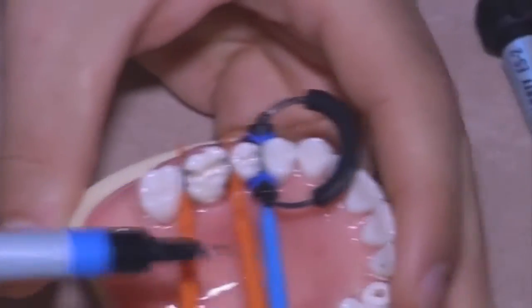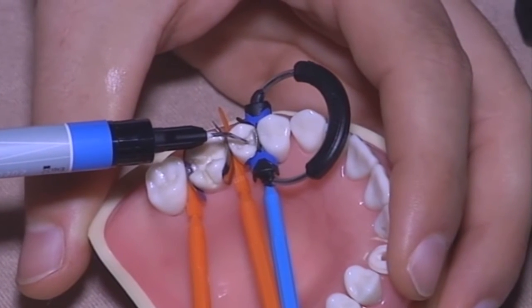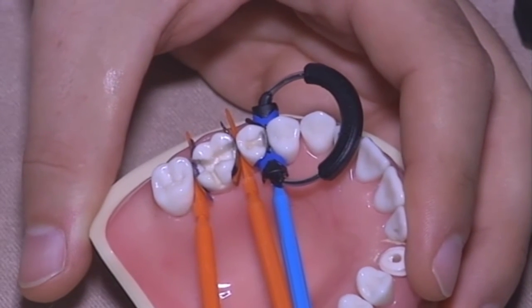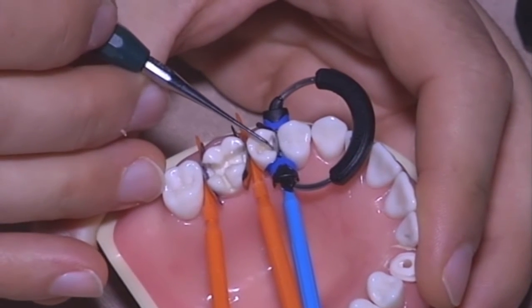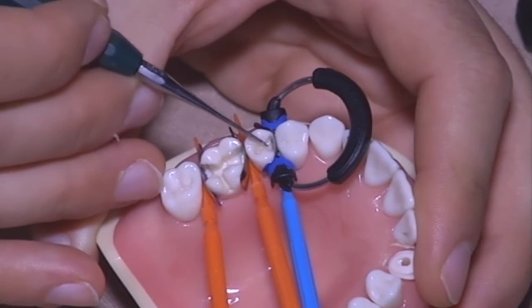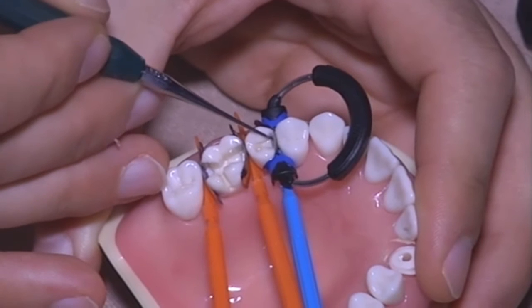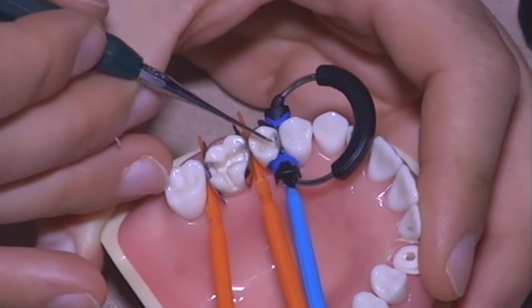Okay, you just need to place a little quantity. I used to place a little drop here, and then with a little pointer you just bring it even inside the proximal area in order to distribute it along all the cavity walls.